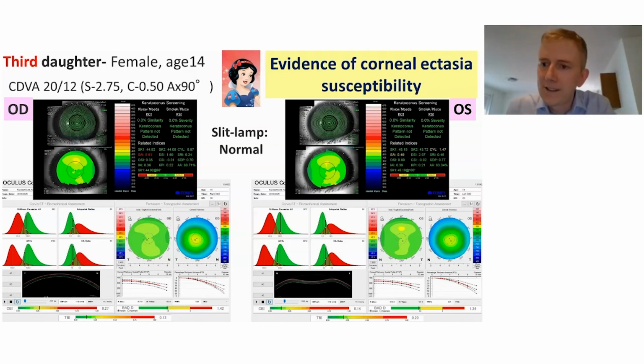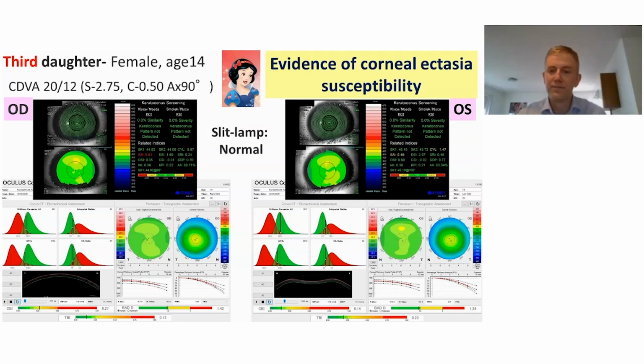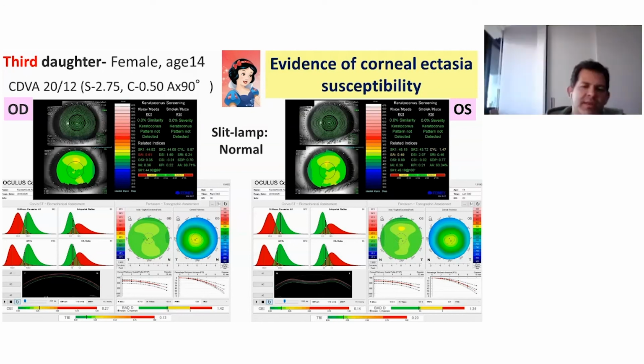Renato, perhaps. I love these cases from Shizuka. I think they are very beautifully taken, and I really like the presentation of the bilateral susceptibility of the daughters. And the message here is treat the allergy and don't rub the eye. But this is very simple. You can tell everyone not to rub the eye, but these are the patients that you have to follow up. And eventually the clinical follow-up is very important.